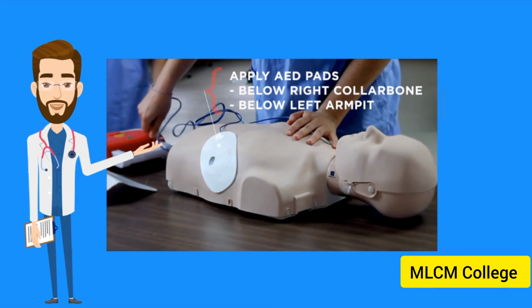When the AED is brought to the scene, begin by turning the device on, remove any clothing from the victim and apply the AED pads, one below the right collarbone and the other to the side of the left nipple below the armpit. Plug in the connector and clear the victim while the AED analyzes the rhythm.